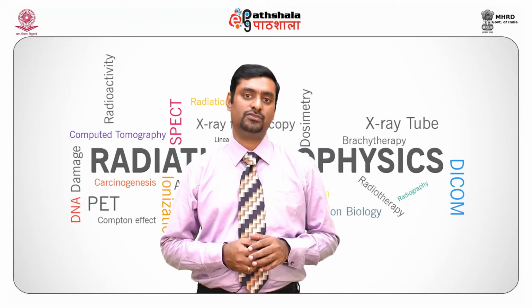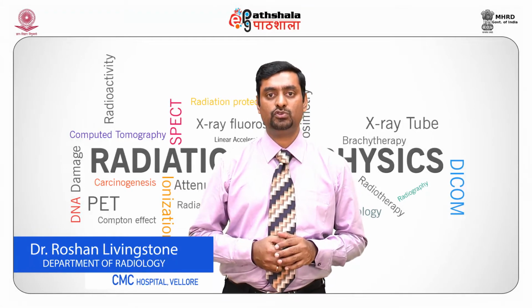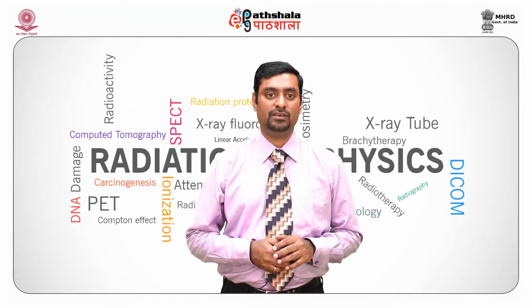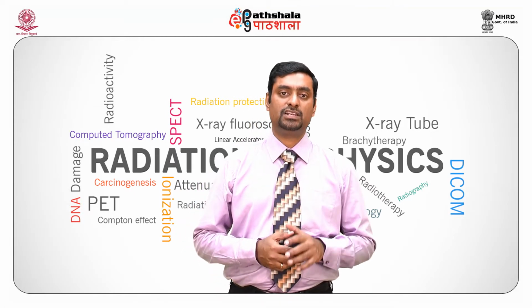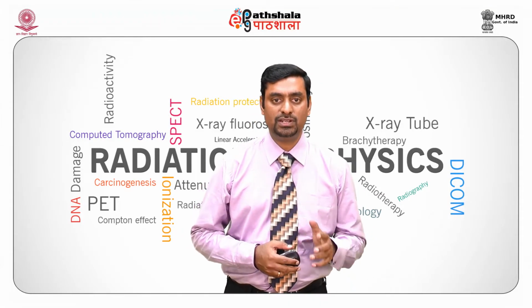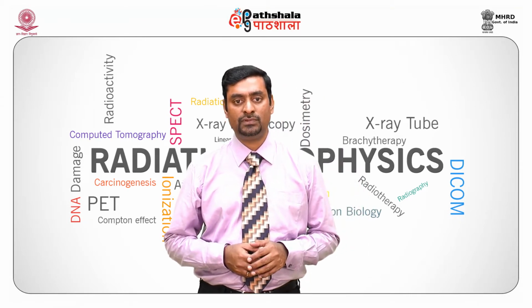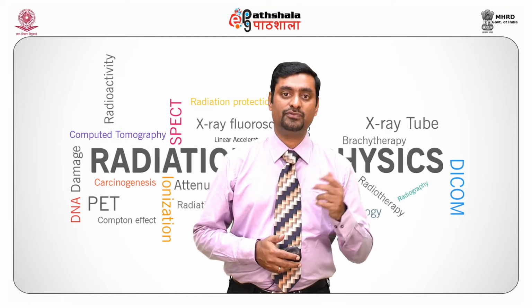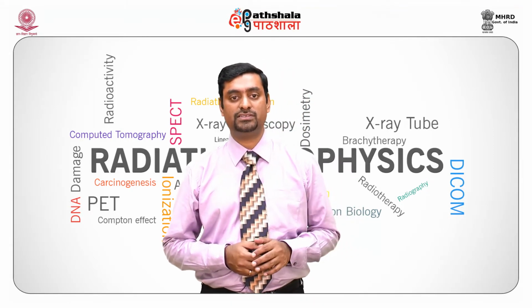What is spatial resolution? Spatial resolution is the ability to distinguish between two different objects separately. Hence, for a film screen receptor, the spatial resolution is about 20 line pairs per millimeter to demonstrate fine spiculations and microcalcifications. It can also provide high contrast details and allows visualization of subtle differences among soft tissue densities.